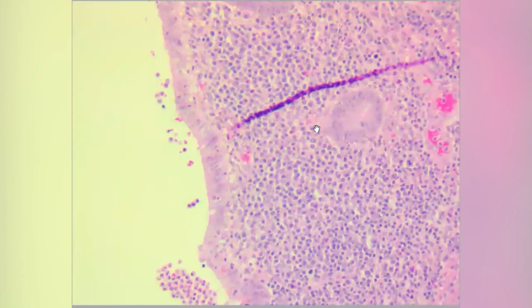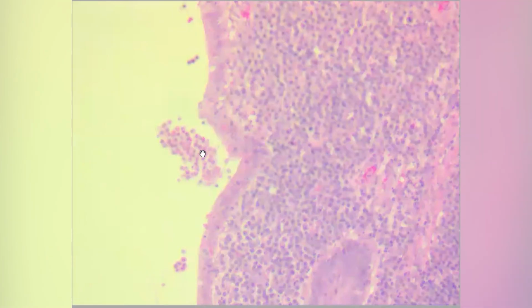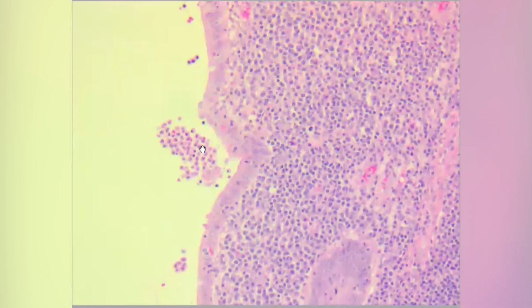Here I'm going to the lumen. And again, here in the lumen, I hope you can see this clearly. Try to adjust the focus. Yeah, these are all neutrophils in the lumen. So this is how we diagnose acute appendicitis.